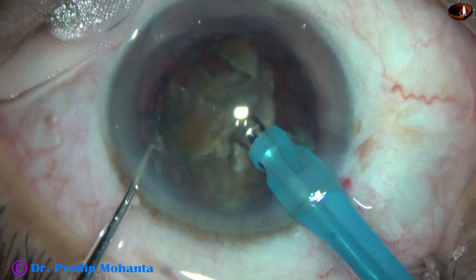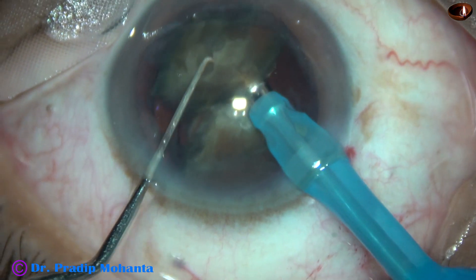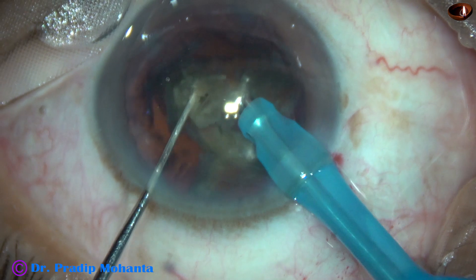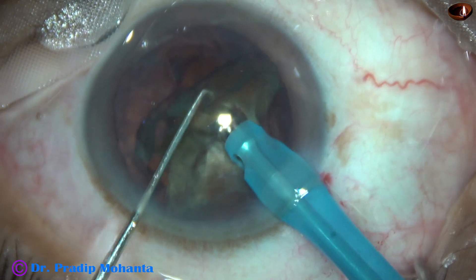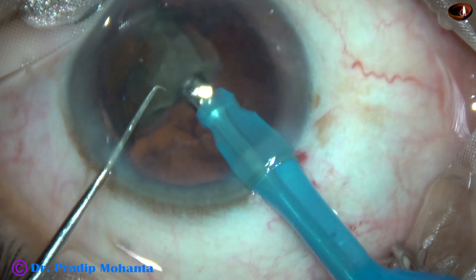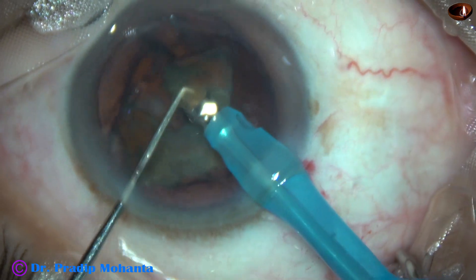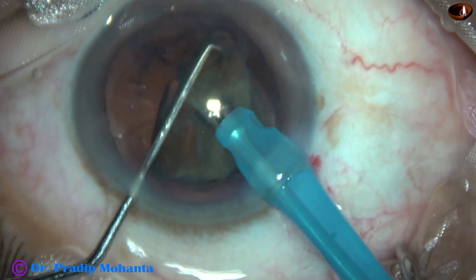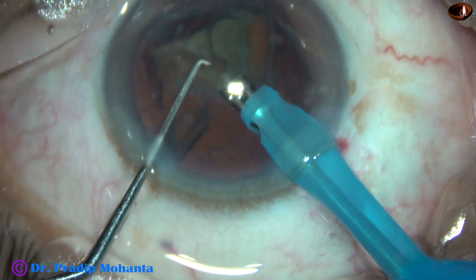This is the second piece — it is almost emulsified. Whenever I don't have to emulsify anything, the foot switch is in irrigation or irrigation and aspiration mode. This is the third nuclear piece — it is almost emulsified. Yes, it is done. And now the final piece. You can come down to phaco on mode, or decrease the vacuum and flow rate to a great extent. In this case I didn't do that — I am still in phaco 2 mode, vacuum 450, flow rate 45. This is the last bead of the nucleus, and it is almost done.